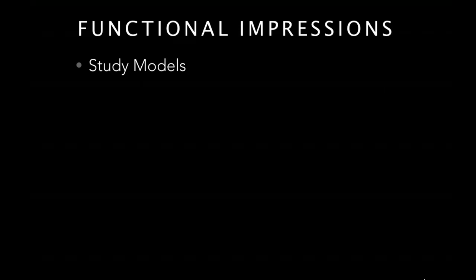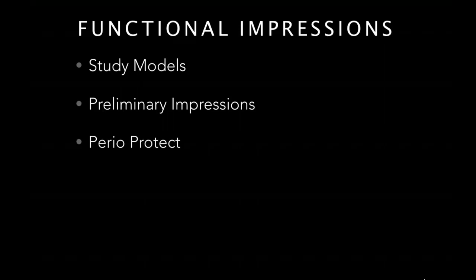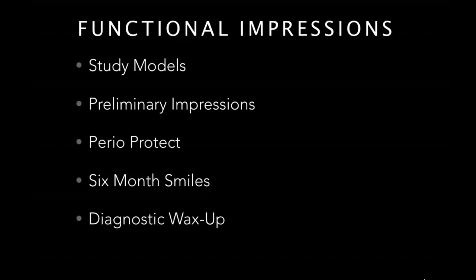I consider functional impressions to be study models, preliminary impressions, and Perioprotect impressions, for those that use Perioprotect. If you don't, I certainly would recommend that you take a look at that. They also include Six Month Smiles, a cosmetic orthodontic, and diagnostic wax-ups. If you're doing a smile makeover, the labs absolutely want you to have a great impression. And for Invisalign, one of the questions sent in was, what is a great way of taking an Invisalign impression? I'm going to show you how to do that tonight, and it's a no miss.